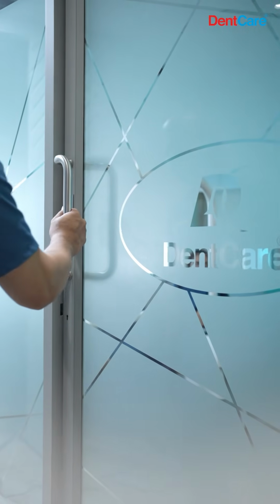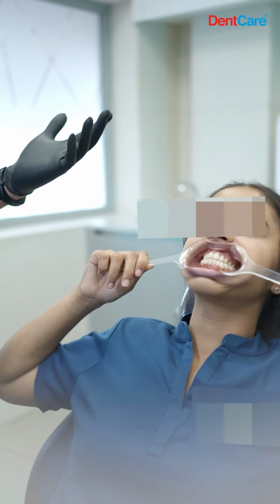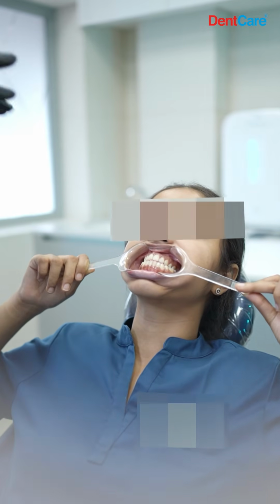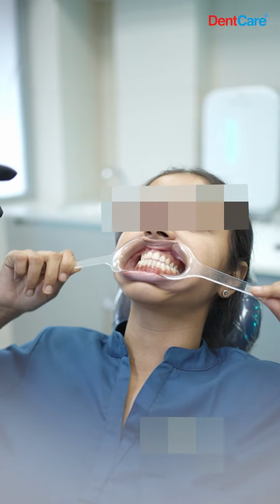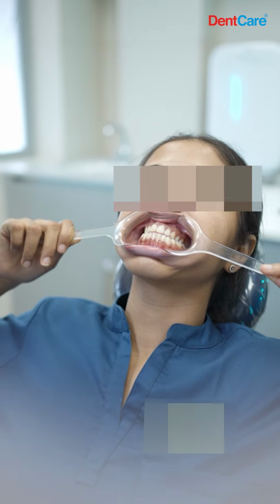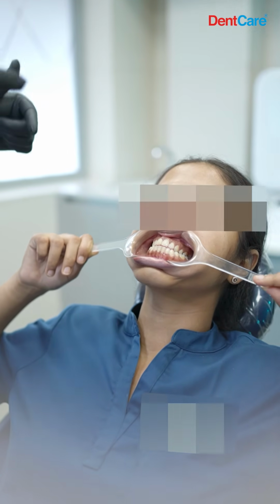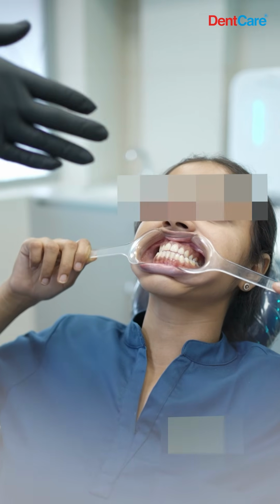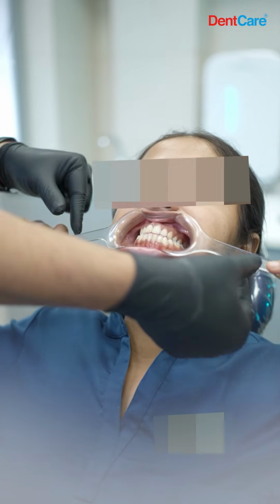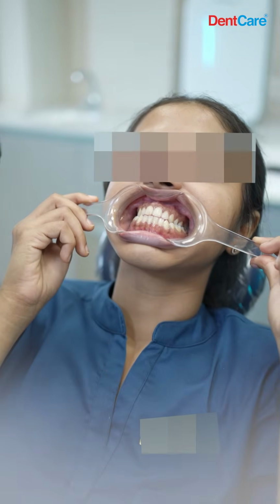Can we see how it's done? Sure, why not? Let's do it. The first thing is lighting. Make sure that your area is adequately lit. Then retraction. Retraction is a very important part of shade selection. We don't want any shadows falling onto the teeth while we do shade selection, and the patient themselves can do the retraction and just replace it like that. Wonderful.